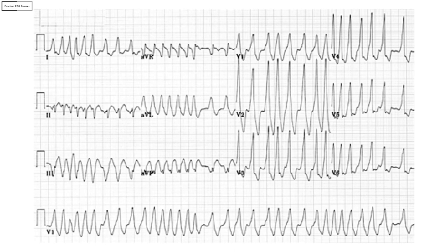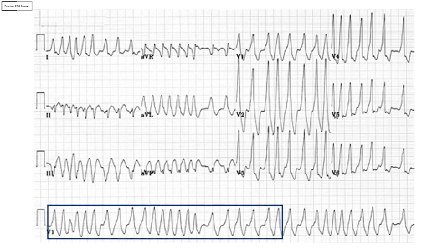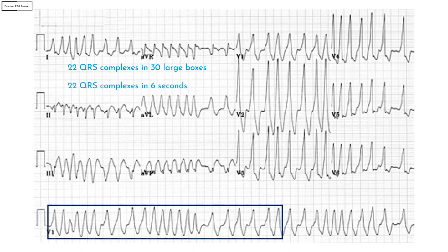The very first thing I notice when I see this ECG is that there are simply too many complexes, which tells me there is a tachycardia involved. Looking at the rhythm strip, it is evident that the rhythm is irregularly irregular. To calculate the rate of an irregular rhythm, you need to count how many QRS complexes are occurring in 30 large boxes. In this case it is 22, meaning 22 QRS complexes in 6 seconds. Multiplying by 10, the heart rate is 220 per minute.